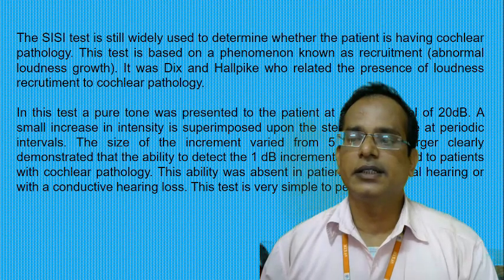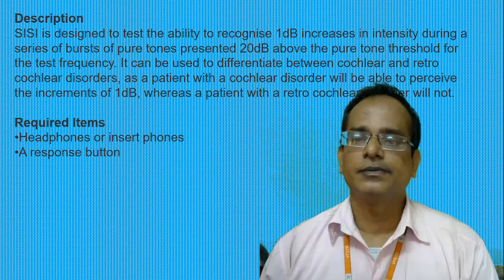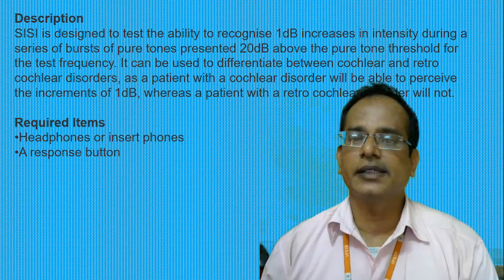The study clearly demonstrated that the ability to detect the 1 dB increment was restricted to the patients with cochlear pathology. This ability was absent in patients with normal hearing or with conductive hearing loss. This test is very simple to perform. So here is the description of SISI.